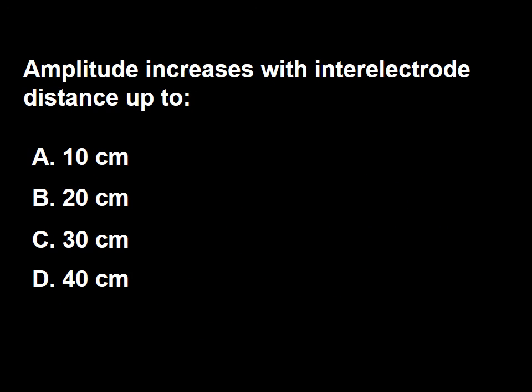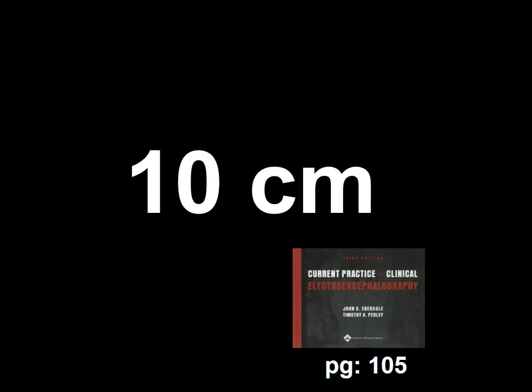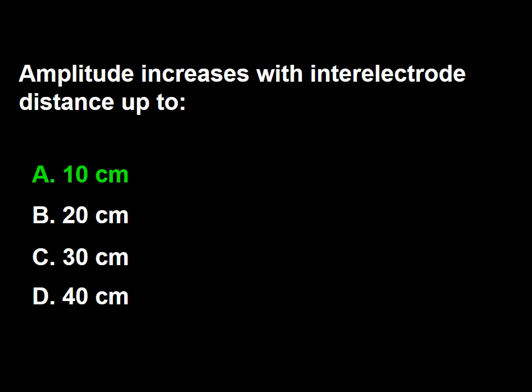Next question: amplitude increases with inter-electrode distance up to A, 10 centimeters, B, 20 centimeters, C, 30 centimeters, D, 40 centimeters. The answer to this question is 10 centimeters. So the answer is A.